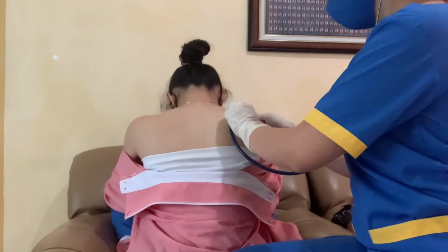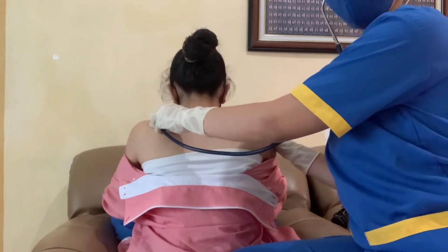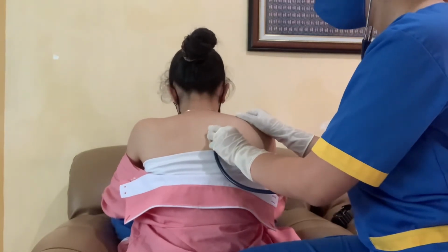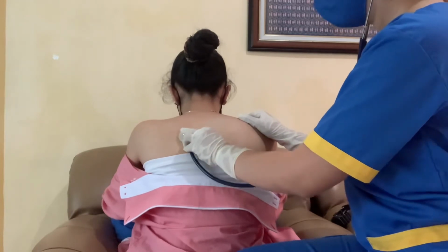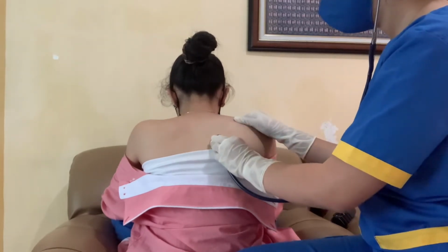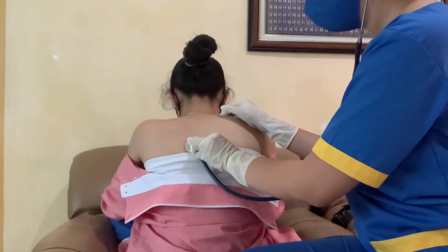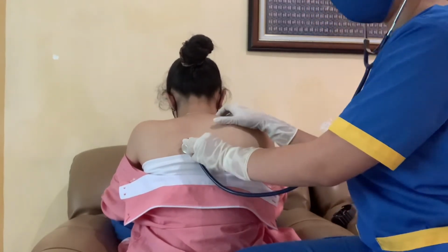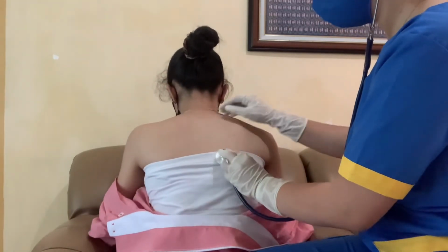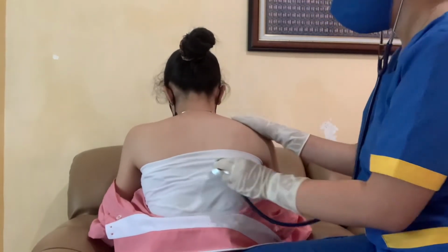Inhale, exhale. Proceed with the second intercostal space. Inhale, exhale. The third intercostal space. Inhale, exhale. The fourth intercostal space. Inhale, exhale. The fifth intercostal space.